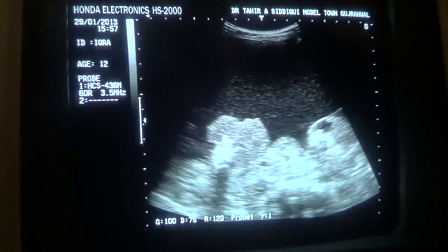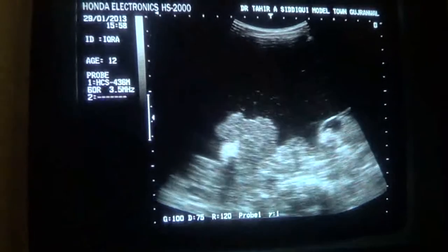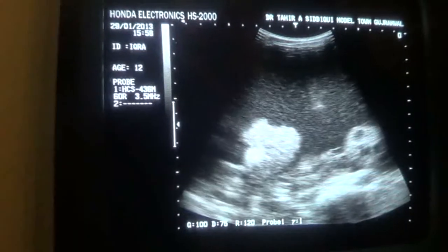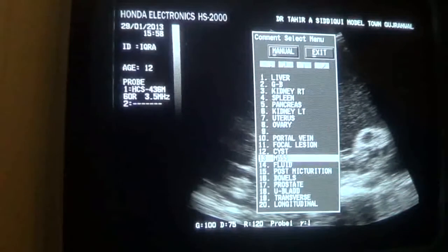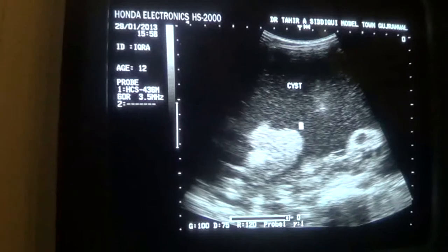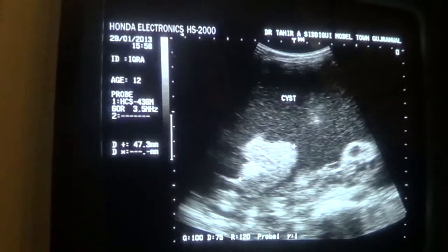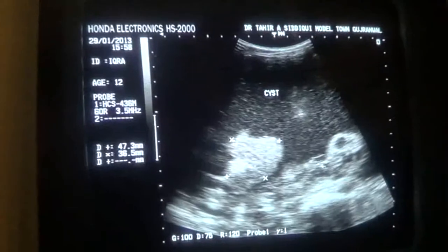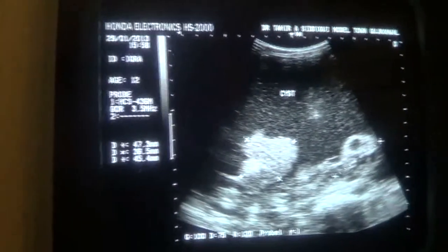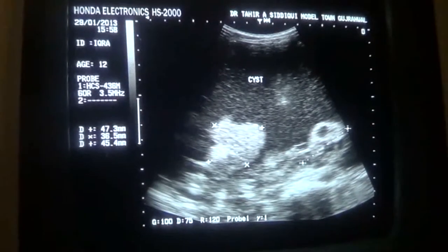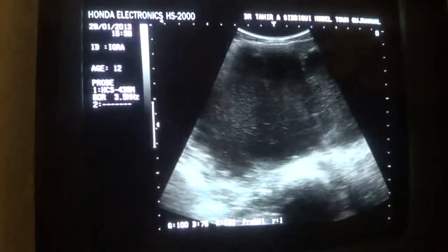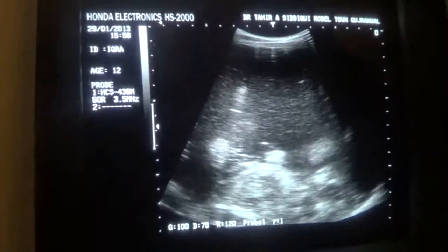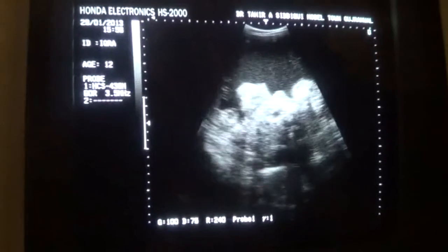This is the echogenic area on the right side. When I increase the gain you can see it more clearly, though it compromises the quality of the image. Now this is the echogenic area on the right side, above the right iliac vessel — this is the right iliac vessel — and this is the area on the left side with multiple cysts within it.